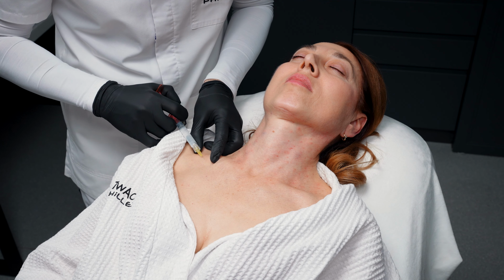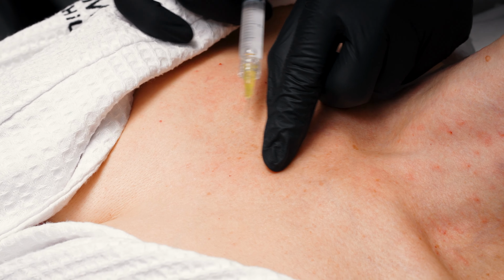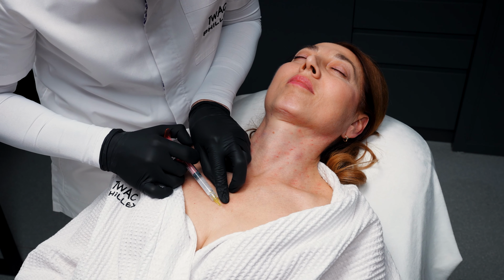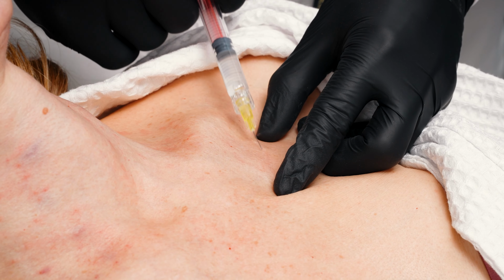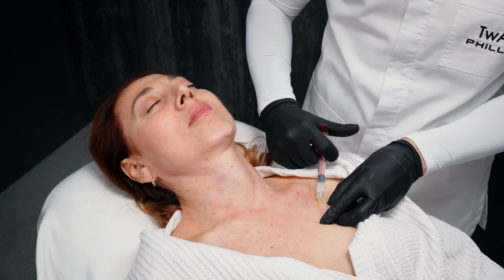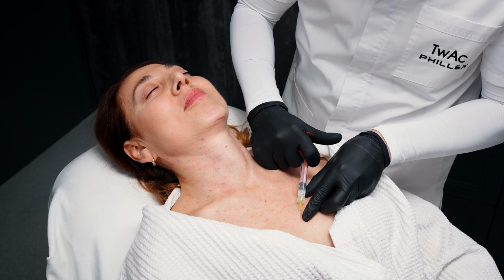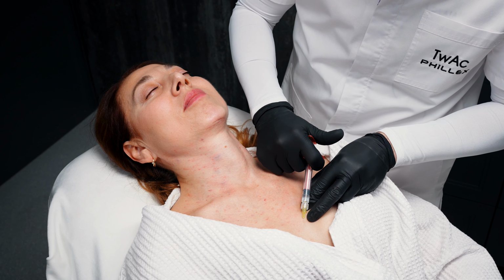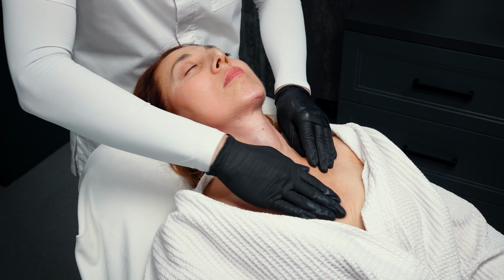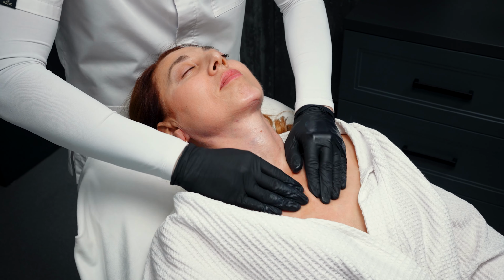Injection technique. Use the retrograde injection technique at an average depth of 4 mm. There should be no significant dermal infiltration or so-called papules. Deep small bumps are acceptable. It is also useful to remember that the deeper the injection, the less painful it is for the patient.